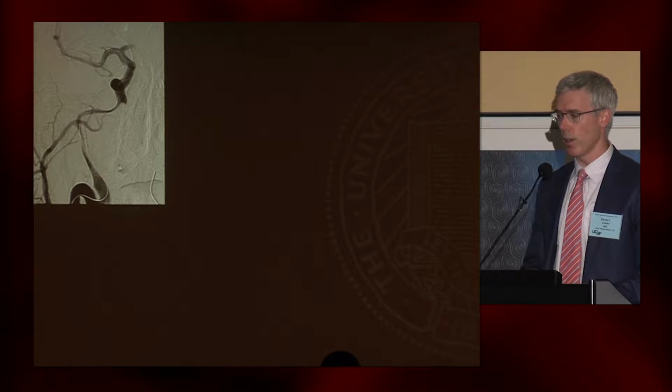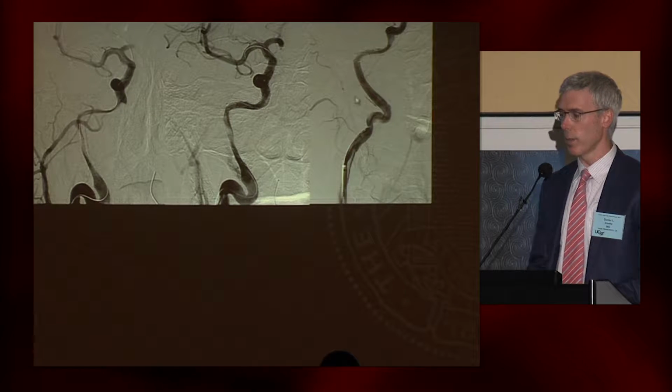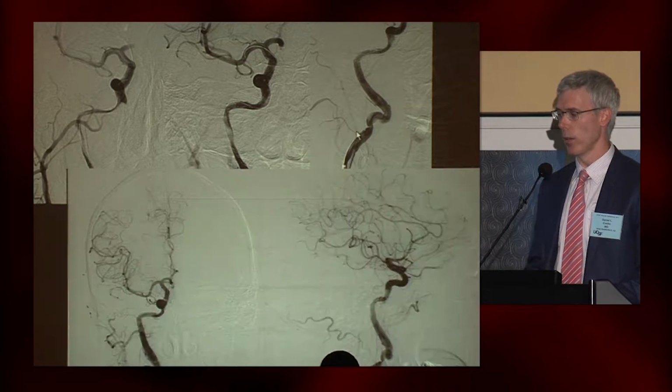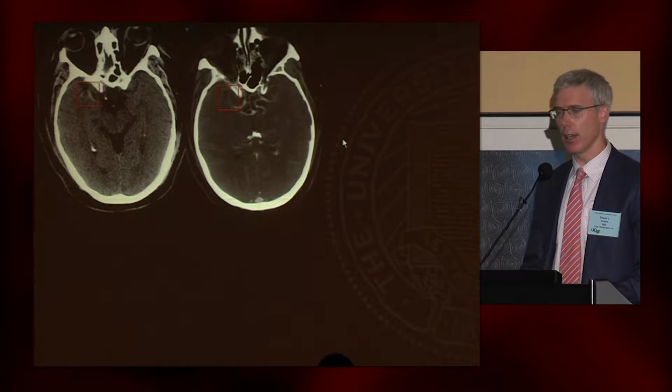So this patient has a long spiral dissection, which extends into the petrous segment. We did some angioplasty, but that was insufficient to really establish flow, and we ended up putting a type of telescoping stents there to reestablish flow completely. So juxtapose that case against this case. So again, a right MCA occlusion.